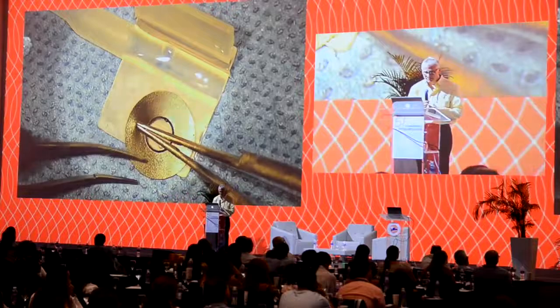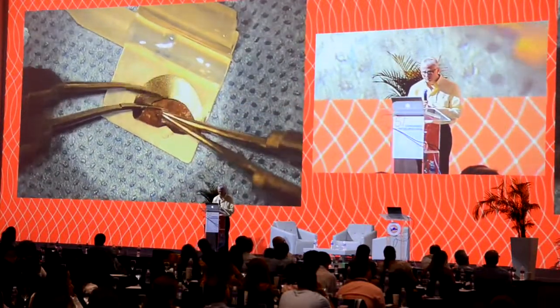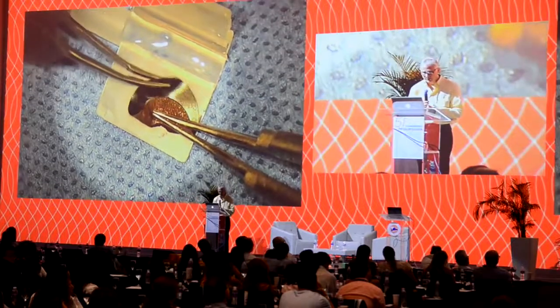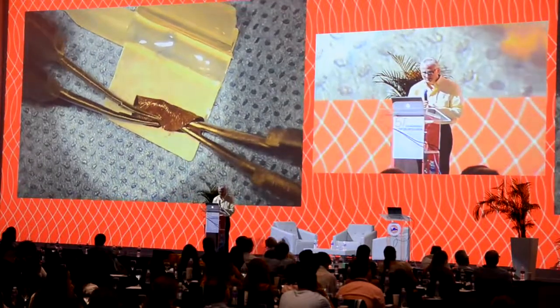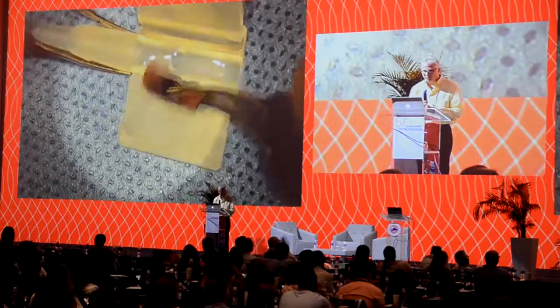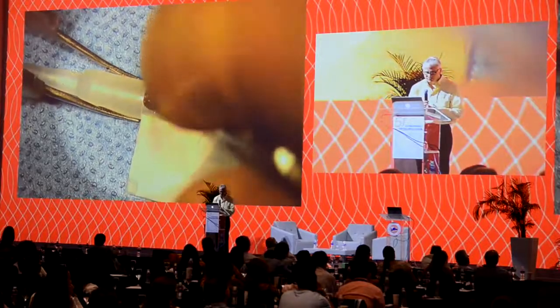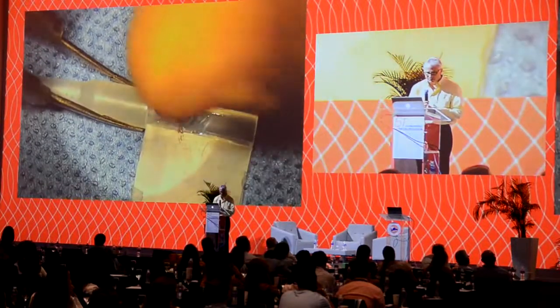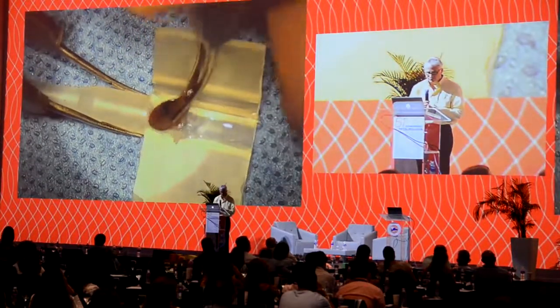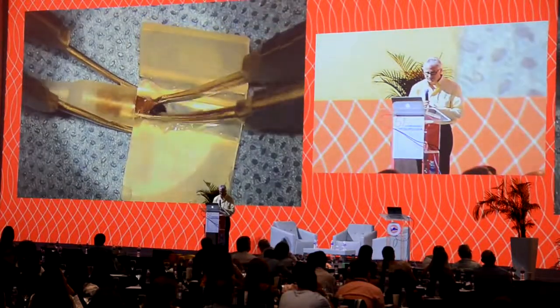We're going to fold this in a trifold fashion with the colored side outward. Always important to have the colored side outward. And then we're going to place it into an implant lens injection cartridge. In this instance, this is an off-label use of the Johnson & Johnson Vision Silver Series injection cartridge, and we kind of tuck it up into the barrel of the cartridge. It's a little bit awkward, but it works pretty nicely.